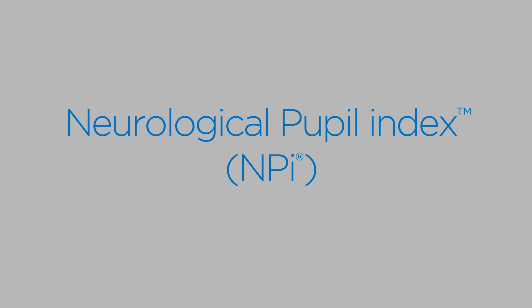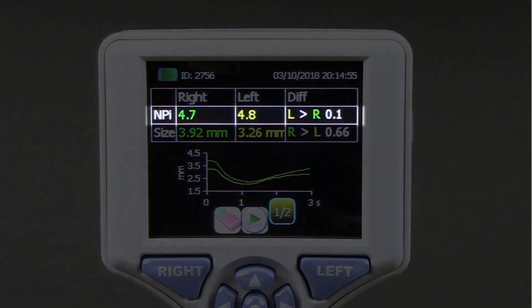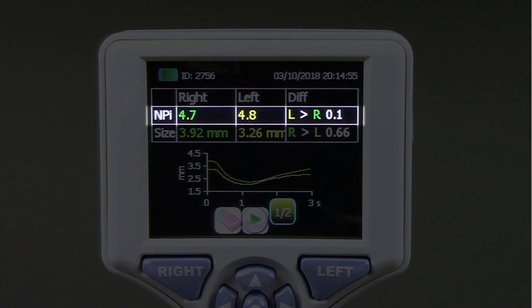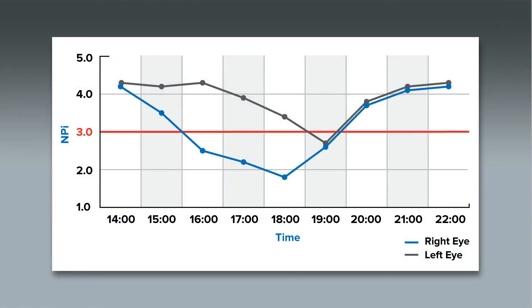The neurological pupil index, or NPI, is a numerical expression of pupil reactivity providing a numerical value which can be trended over time for changes, just like other vital signs. Now, instead of guessing that a pupil is reacting as brisk, sluggish, or non-reactive, pupil reactivity is expressed numerically as NPI.